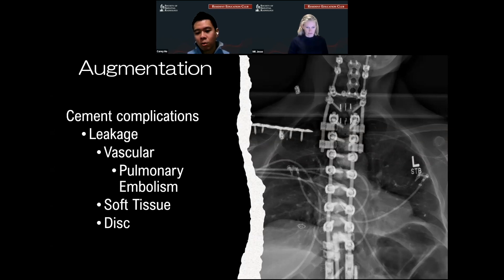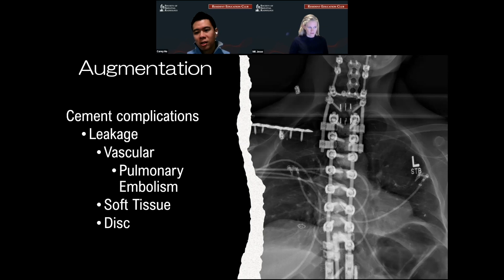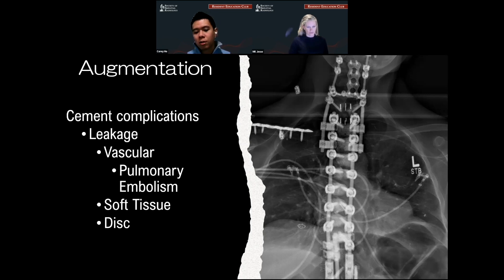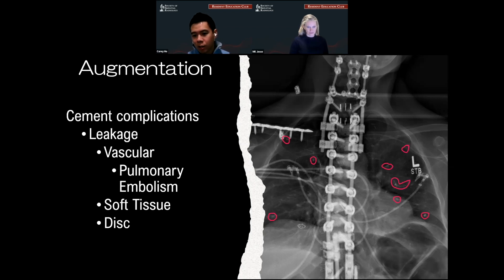The other place cement can go is soft tissue. Because this is an exothermic reaction when the cement hardens, it can cause thermal injury. Cement can also go into a disc, which can cause a theoretical risk of adjacent level fracture. We all read a lot of plain films — you can see this surgeon got a little exuberant with the cement. If you look hard enough, you're going to find that a lot of these post spine surgery patients do have cement emboli embedded in their lungs.